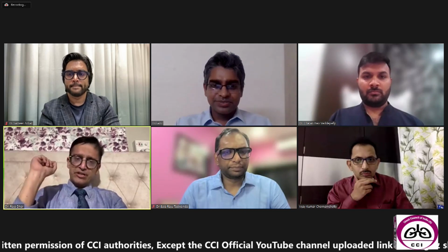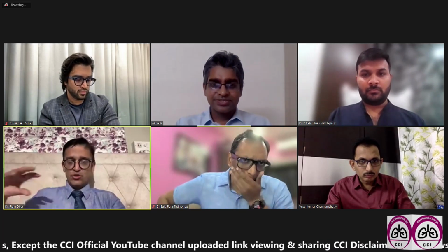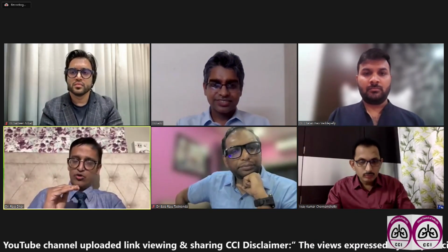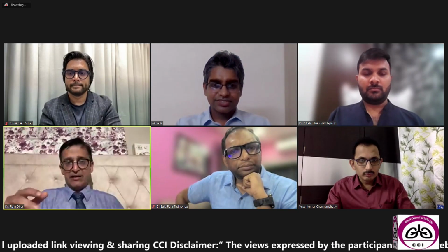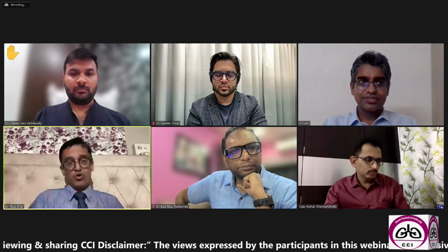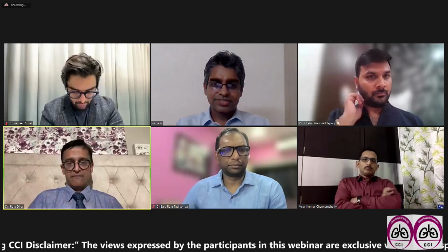Sure. So, Anirudh, I'll modify my question. Sorry, I'm interrupting. I did not talk about thoracoscopic biopsy. I talked about VATS biopsies and open lung biopsies. That's one category. And about your comment on TBLBs, the traditional transbronchial lung biopsies, my question was, is there a diagnosis within the ILD umbrella where you would still get a very good yield using the TBLB and you wouldn't go and do a transbronchial cryobiopsy in these patients?